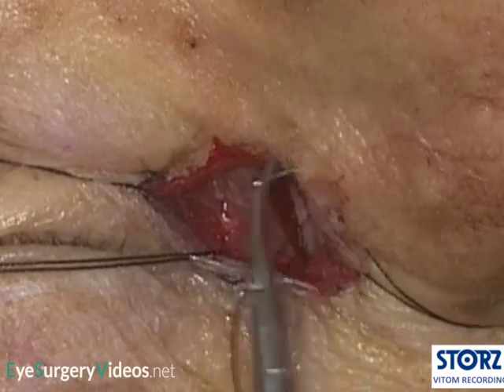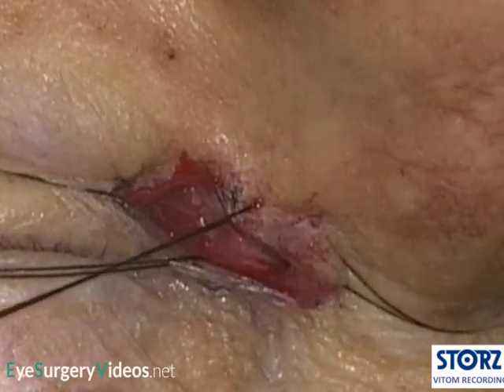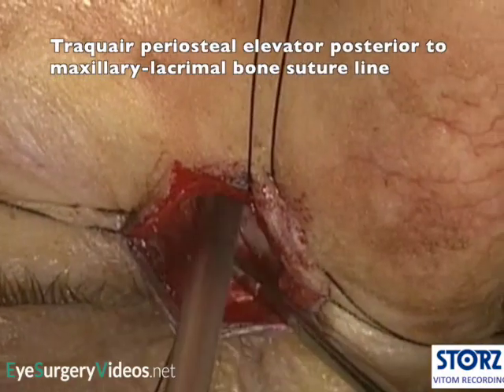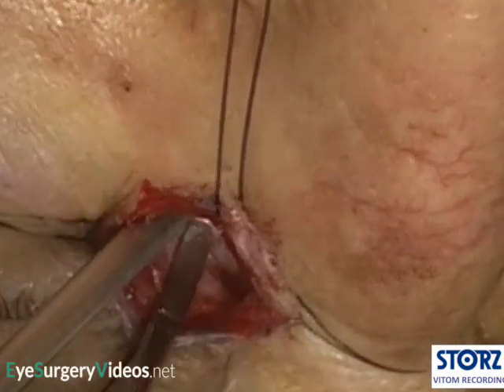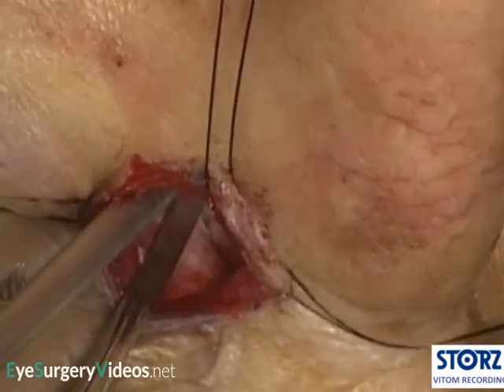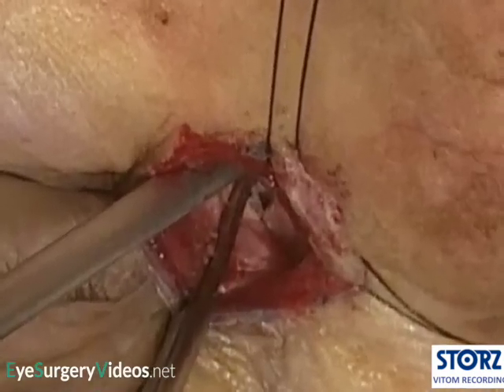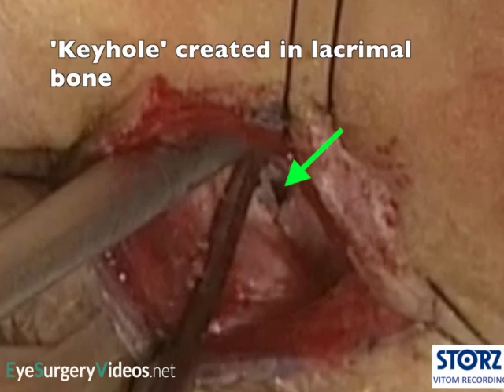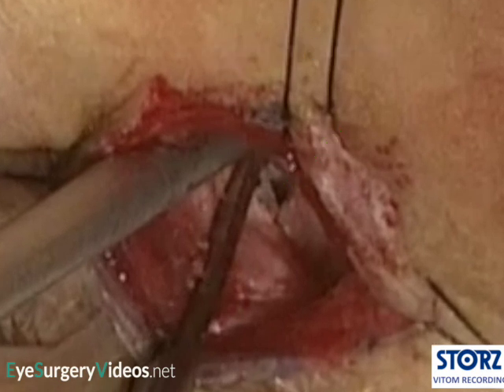A periosteal elevator is slid posteriorly along the tough, thick maxillary bone until the soft bone is felt. This will give way either at the suture line between the maxillary bone and the thin lacrimal bone, or slightly more posteriorly at the anterior lamina papyracea. The heel of the elevator can be pushed gently inwards to create a defect.